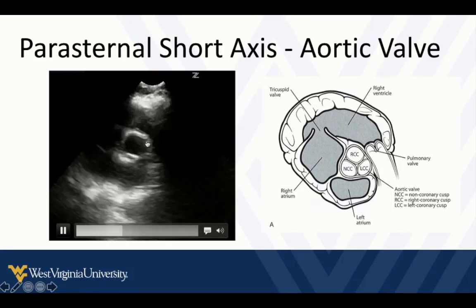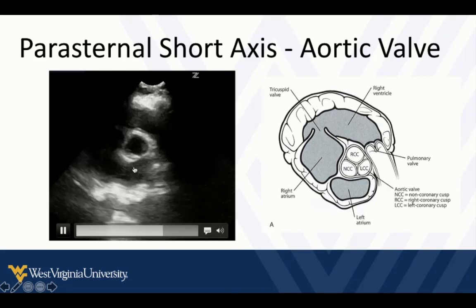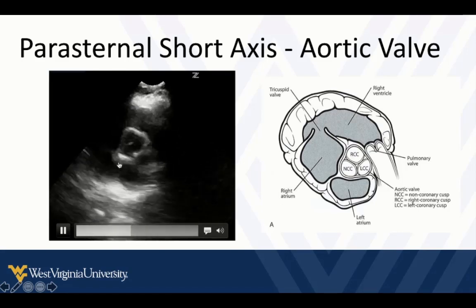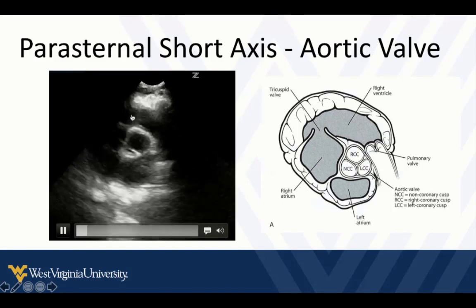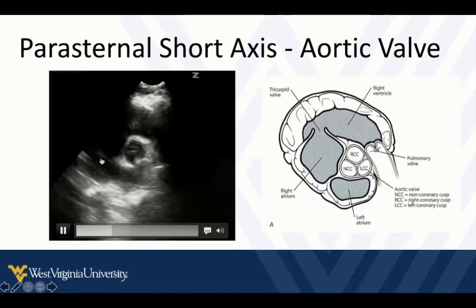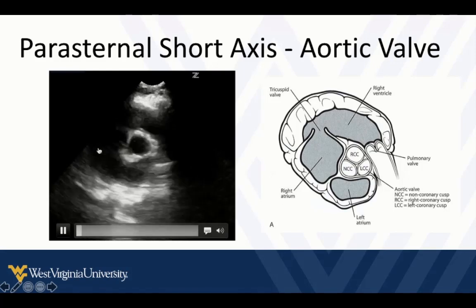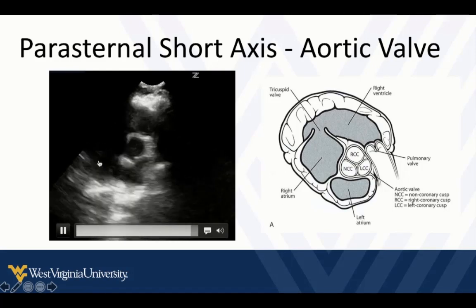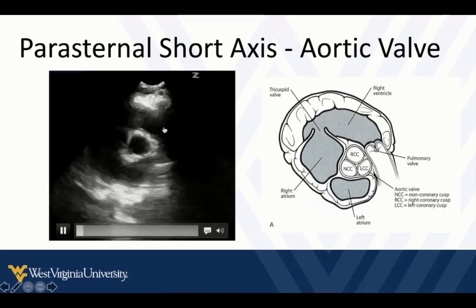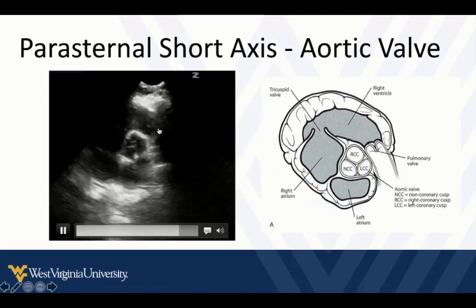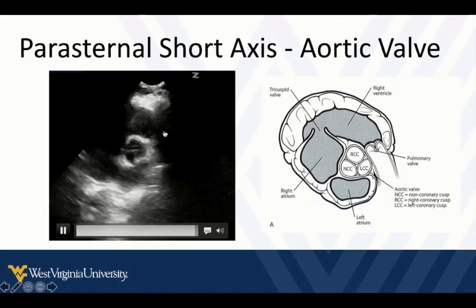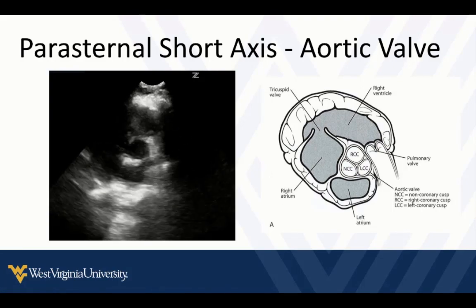We have the cross section of the aortic valve, and behind that is the left atrium. The structures of the right heart wrap over top of the aortic valve across the screen — we have the right atrium, tricuspid valve, and blood flows from the right atrium through the tricuspid valve into the right ventricle. We can often just see a hint of the pulmonic valve as well, though that's sometimes harder to see in transthoracic echo.